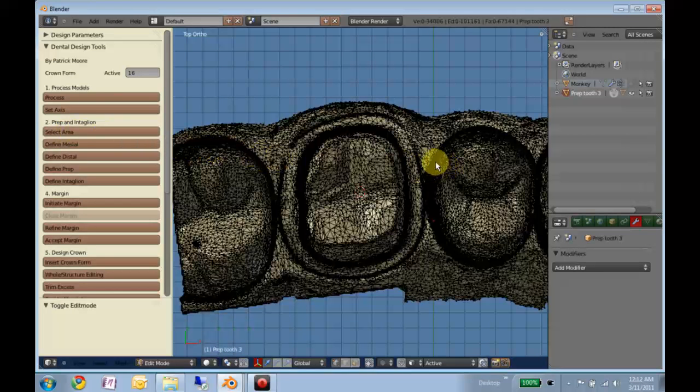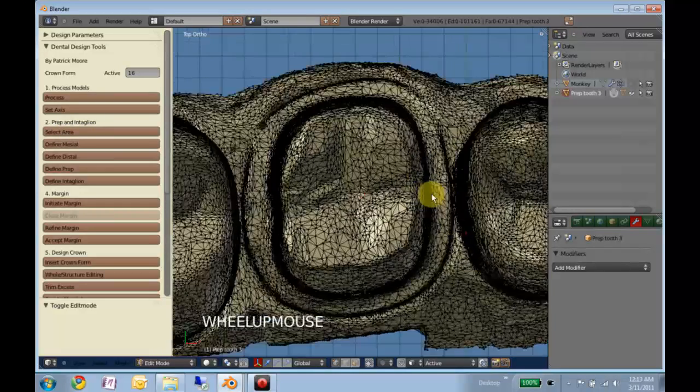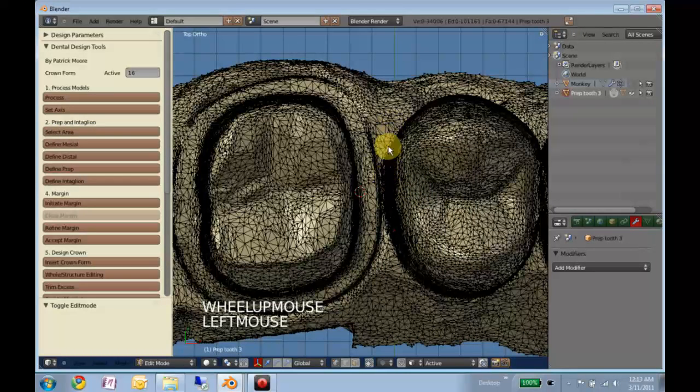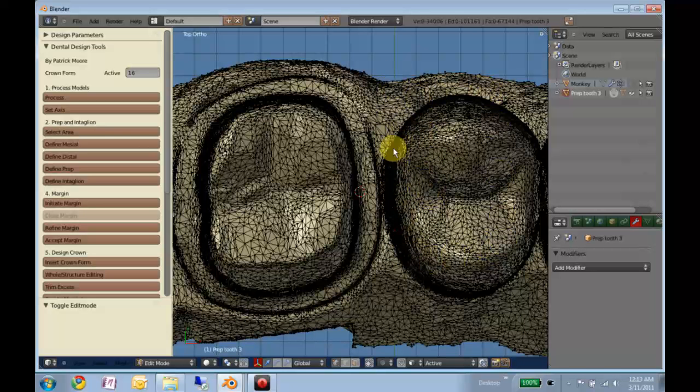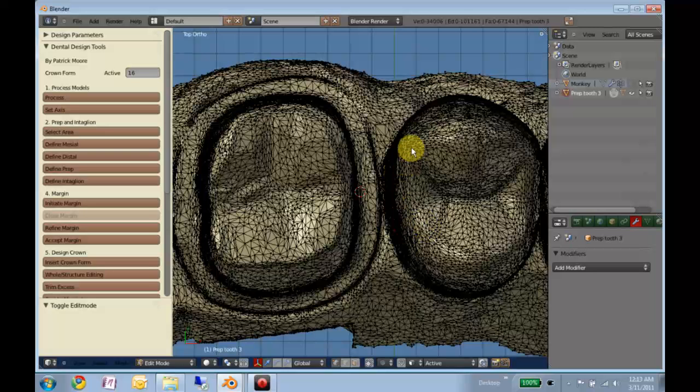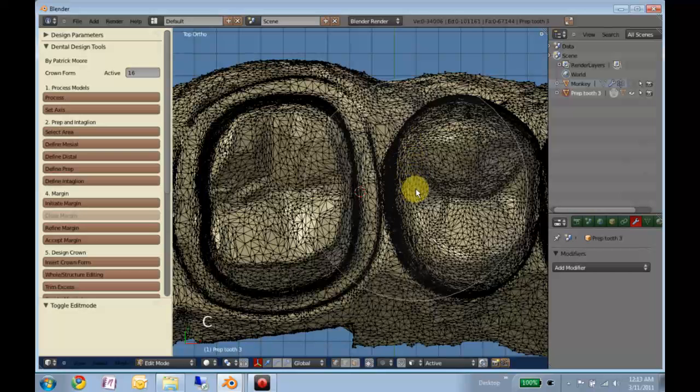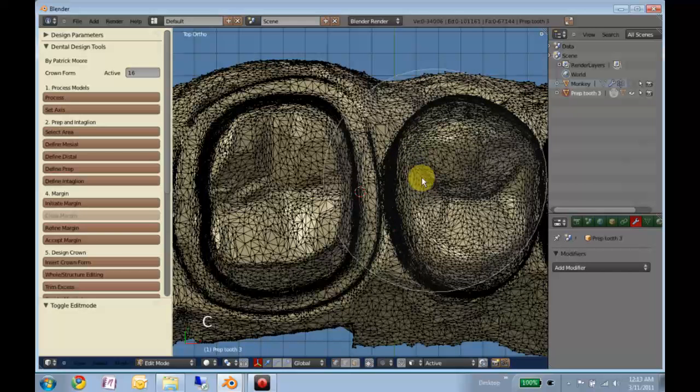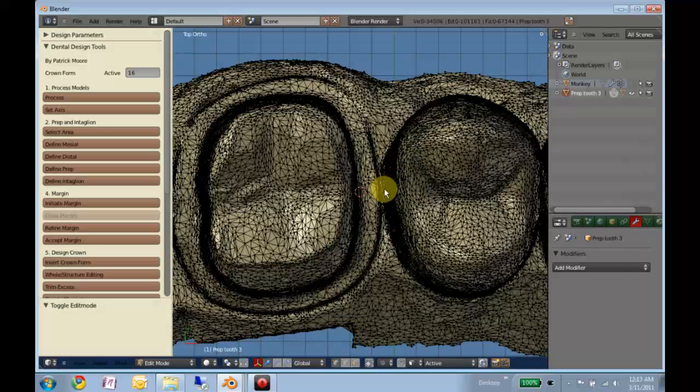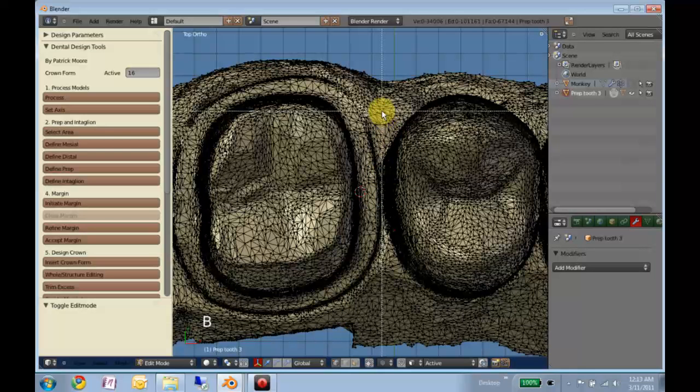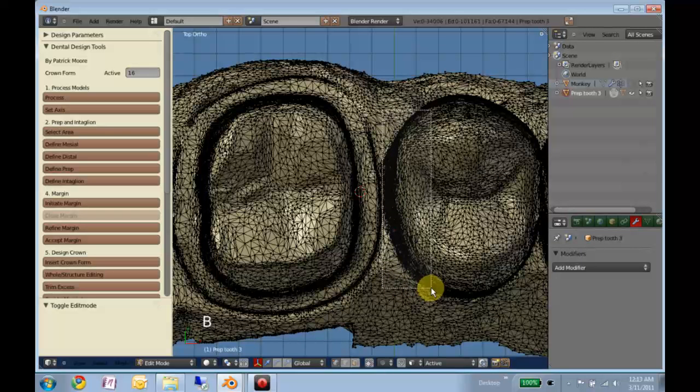Okay, so there's several ways we can do this. The first thing we want to select is the distal surface of the mesial tooth. You can select as much of it as you want, but I find that you have just this area here. And we can hit C to circle select, and scroll up, and select it. But what I find is easy, especially when contact's been broken nice and cleanly, if you hit B, you can select just like you would in many other programs.